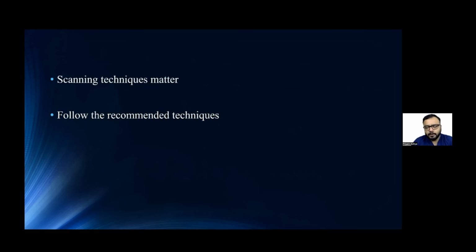In the beginning, you can see and follow the scanning techniques which are recommended by the company. It blinks on the side. You can actually follow it and do it. And once you master the recommended techniques, you might take some shortcuts. You might develop your own techniques and share it with us, which might be even better than what the company is doing. But in the beginning, follow the techniques that the company is recommending. It definitely helps in recording a better scan.